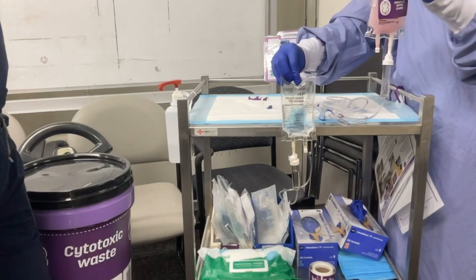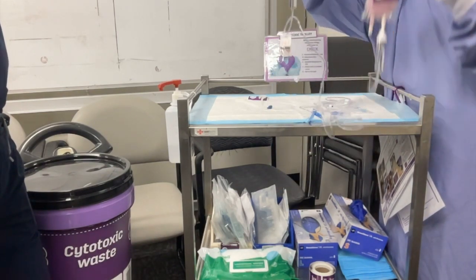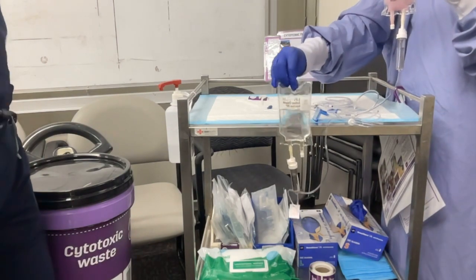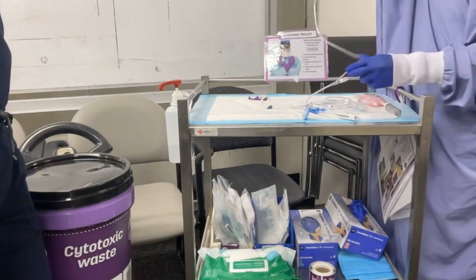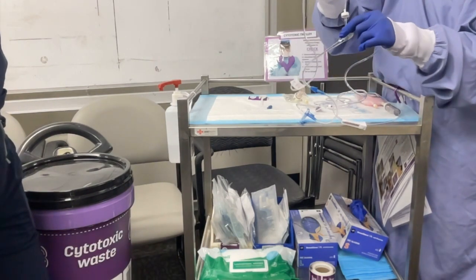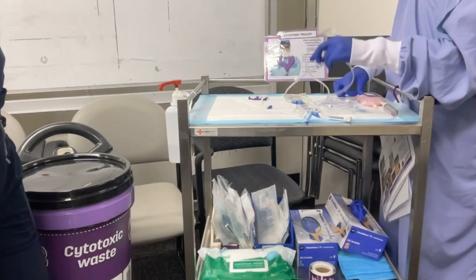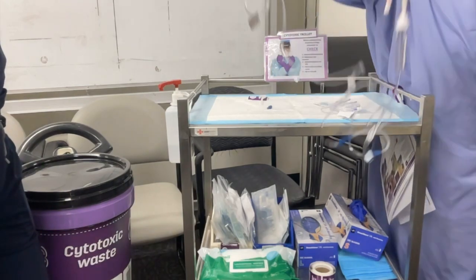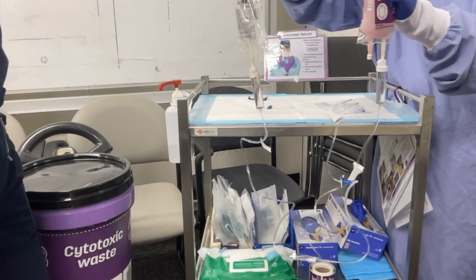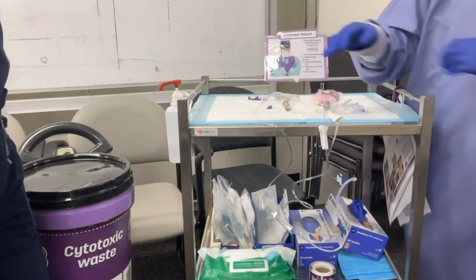The medication doesn't go into the fluid maintenance, while the fluid maintenance can go to the cytotoxic, and this one doesn't. Because of the valve? Yeah, on the line. Beautiful, that's it. So we've got a valve here that prevents two-way flow and only allows one way into the line. Lovely, and now we've got a closed safety system administration for IV hazardous drugs.